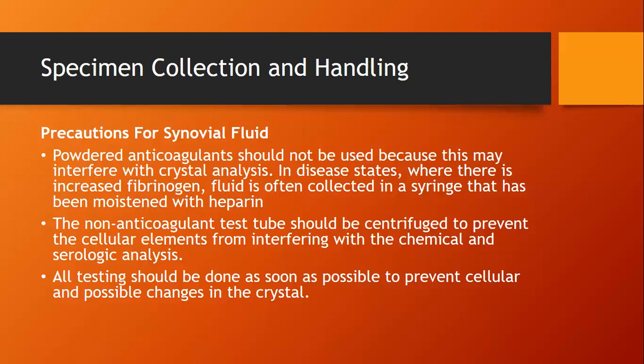I mentioned that your synovial fluid does not normally clot. But how come in disease states when there is increased fibrinogen, we opt to use an anticoagulant, which is heparin? It's because fibrinogen is actually a clotting factor, which is responsible for increased clot formation in synovial fluid. And if your synovial fluid is clotted, we could not proceed with the analysis.